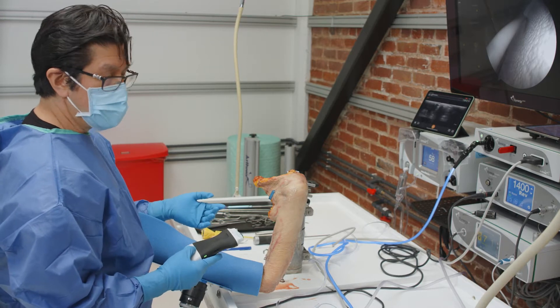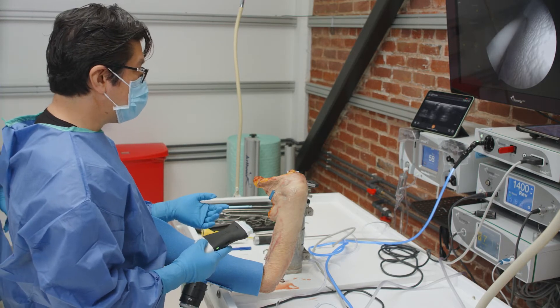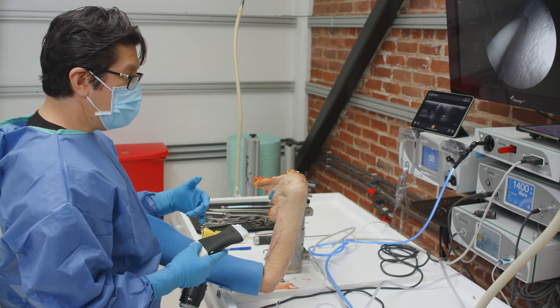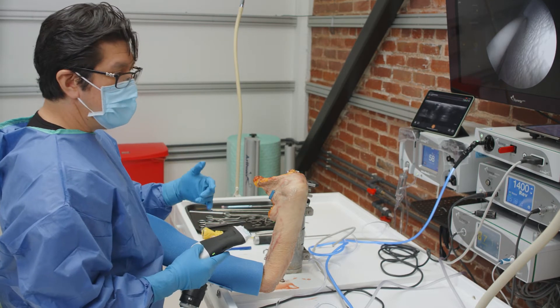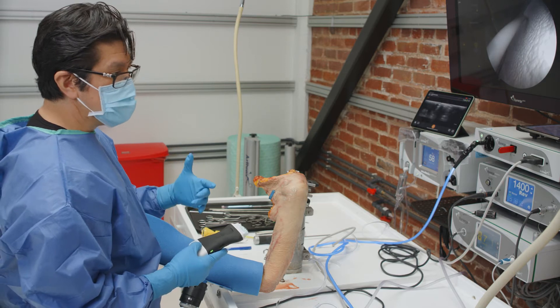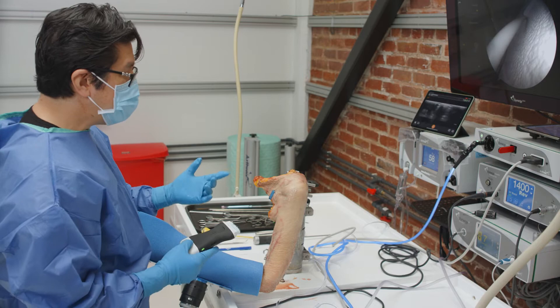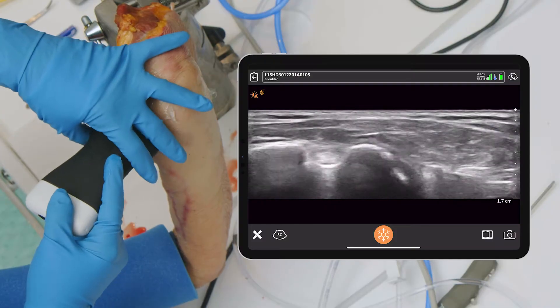The problem with that approach is you can easily hurt and damage the supraspinatus tendon. With this technique, the biceps comes through the notch, exits the notch, and exits all the soft tissue just before it dives under the pec. So we can take advantage of that and go directly to the spot.